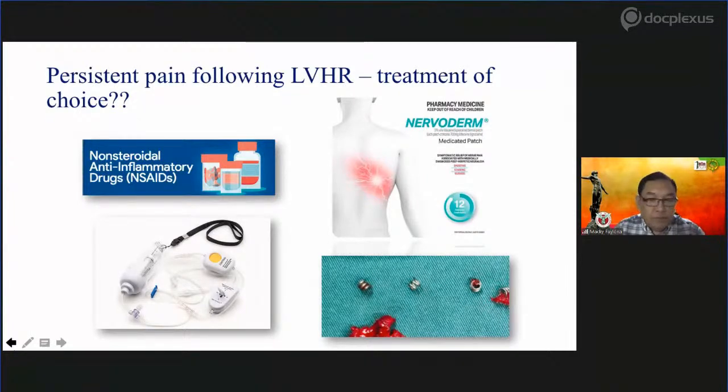Yeah. One thing that we also do in our hospital is that even before distending the abdomen or even before the induction, we sometimes use the ultrasound to mark the defect size. And you may have an idea already as to how big the defect is pre-laparoscopic or pre-insufflation. So that could also help you in measuring the defect, aside from doing the measurements during your procedure.